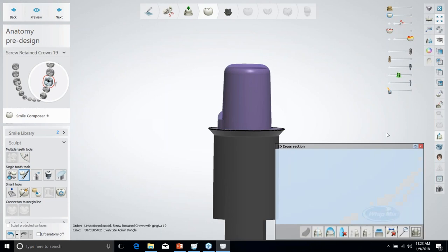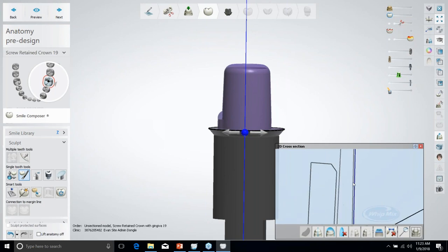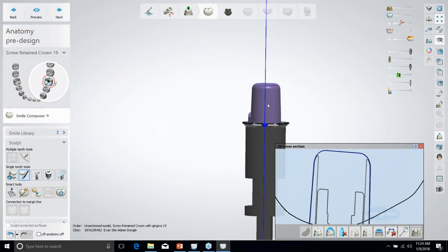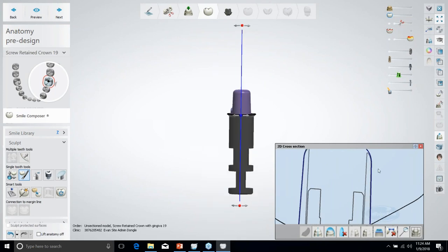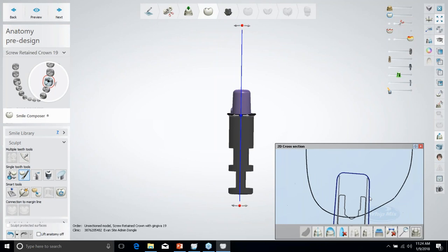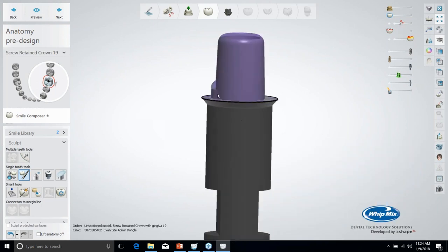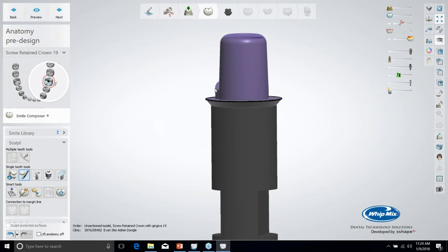If we do a 2D cross section really quick, we can see, gotta zoom in pretty close. Right here, this is the outer wall of the tie base. This blue is what's going to be the internal of our zirconia crown. Once we actually apply that to the crown, we'll be able to measure it. But essentially, this gap is determined by the manufacturer of that tie base, and you can't change it. So if you're feeling like the fit's too tight, then you may want to investigate a different manufacturer's library. Or if you find that the indexing nub that NT Trading uses isn't enough anti-rotational indexing, then you might want to look at a different manufacturer's system.